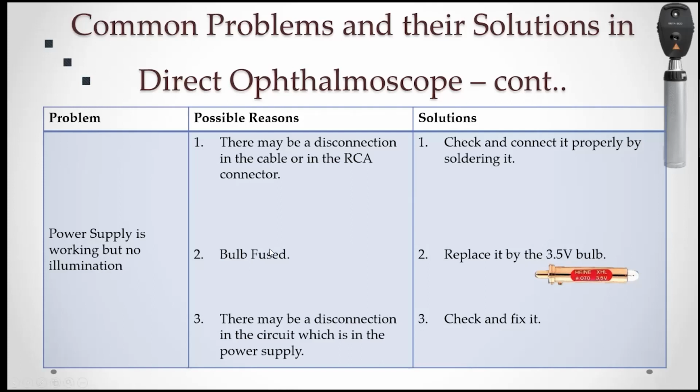Sometimes the bulb has fused, so you have to check and replace the bulb. The only thing you need to check is the rating of the bulb. You have to ensure that you are replacing it with a bulb of the safe rating.